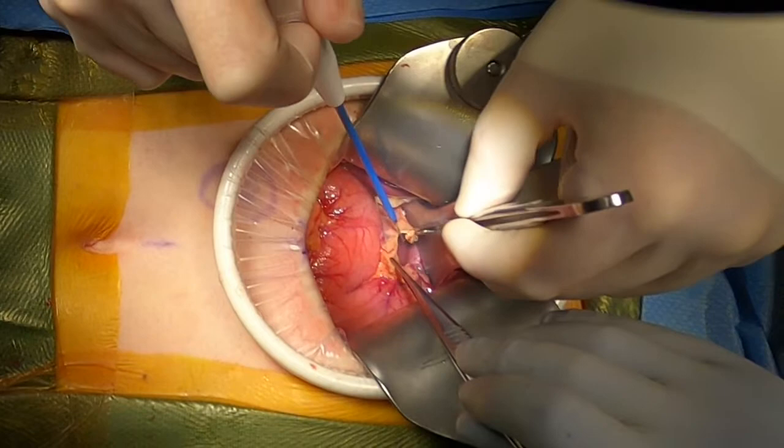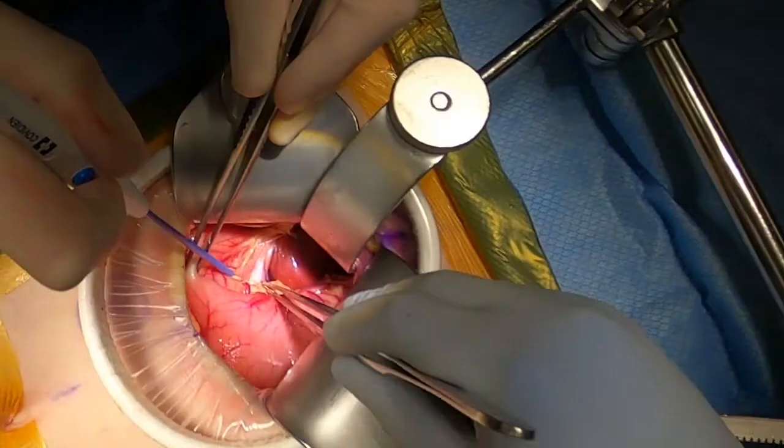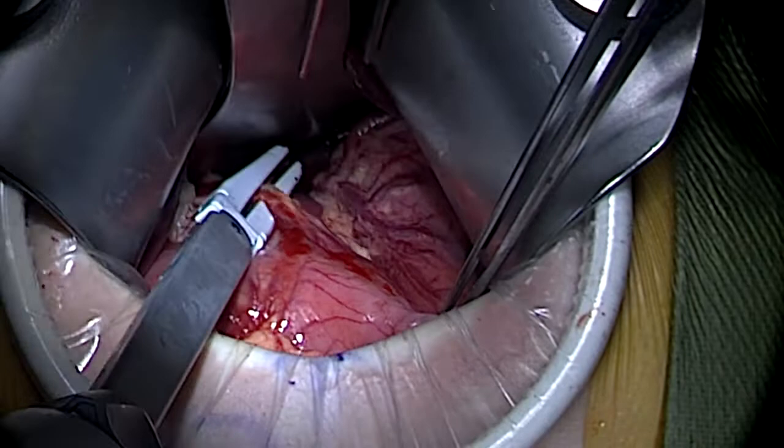Retracting the stomach caudally, we then opened the gastrohepatic ligament close to the liver. A common landmark is the hepatic artery lymph node overlying the hepatic artery, which thereby helps with identification of the right gastric artery. The right gastric artery is then divided, which can be completed with a vessel sealing energy device.